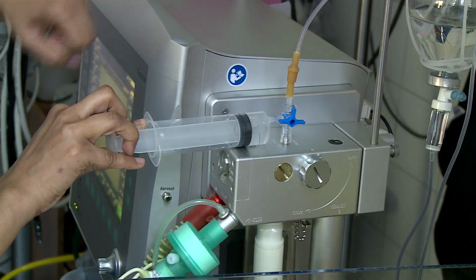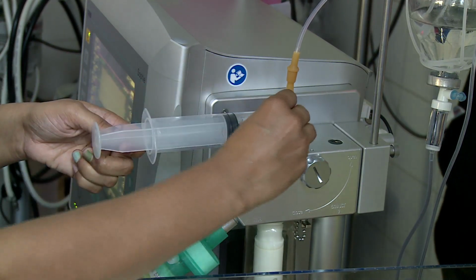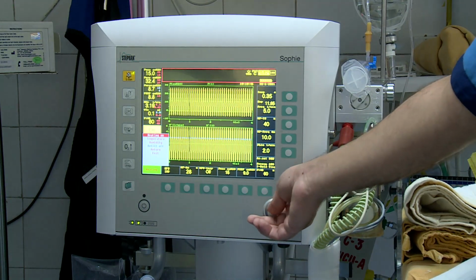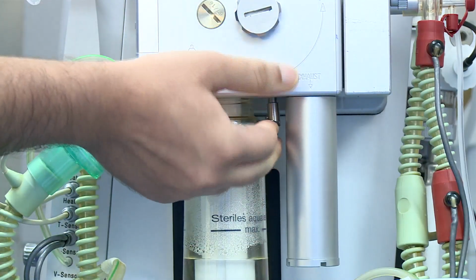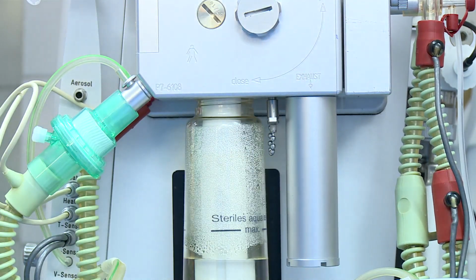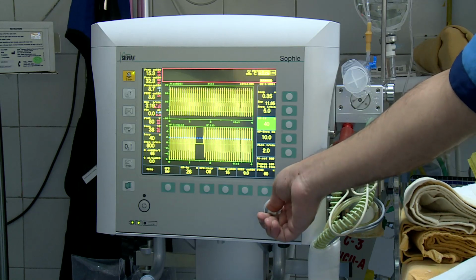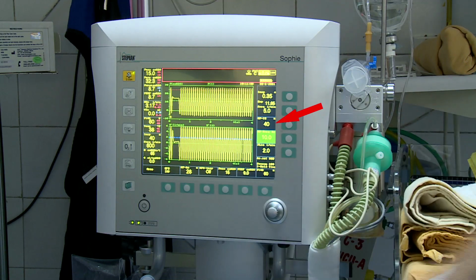Ensure that the humidification bottle is filled with water and the heating system is on, as seen in the main drop down menu in the computer screen. Close the safety valve, which is present on the right side of the ventilator, with the HFO sealing cap. Choose the required inspiratory proportion from 33 to 50%, roughly a 1:2 or 1:1 ratio.